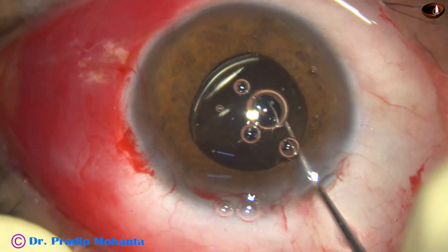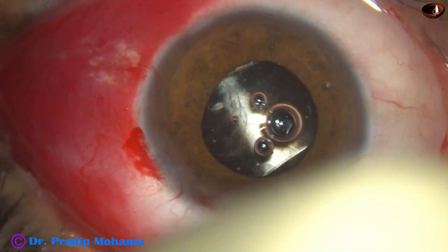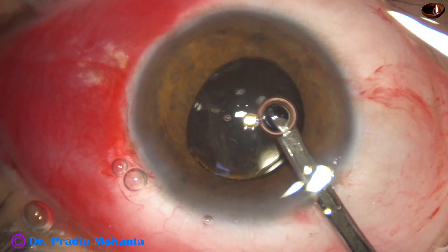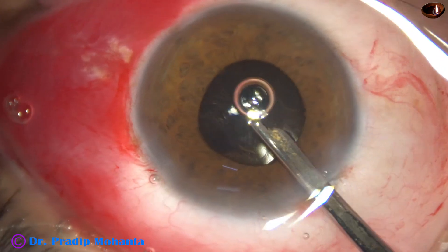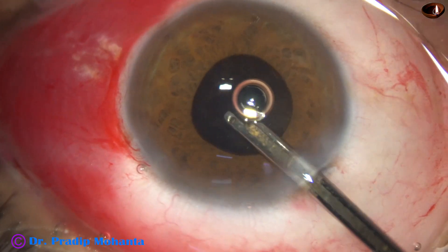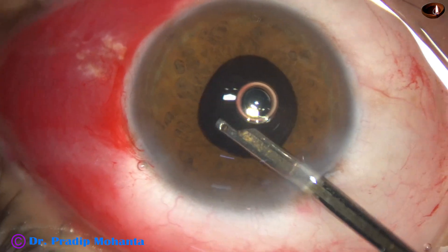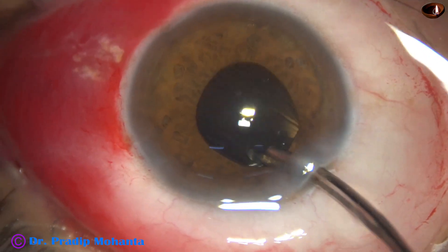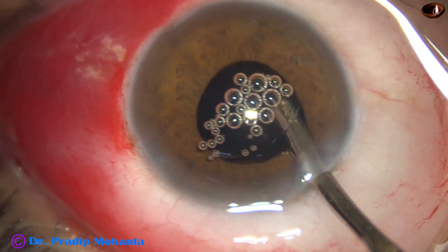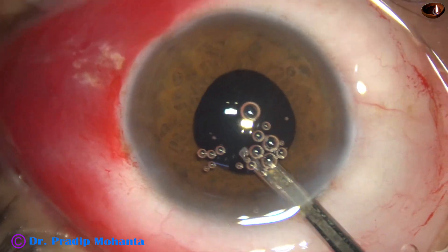Now we just have to remove the visco that we have used for implantation of the intraocular lens. The lens has been placed in such a way that we can go behind the lens easily. The visco is being cleaned first with the help of the 23G Simcoe — go behind the lens, irrigate and aspirate the capsular bag, and come out.